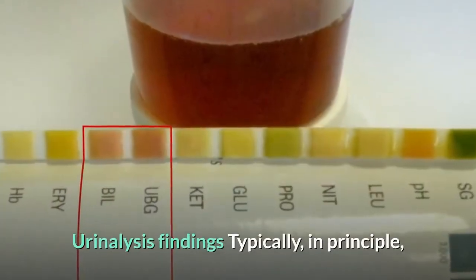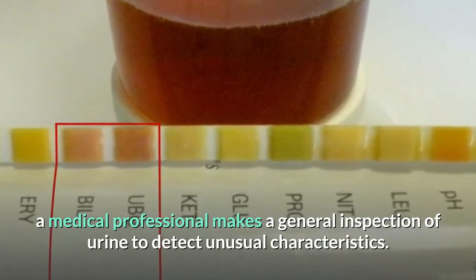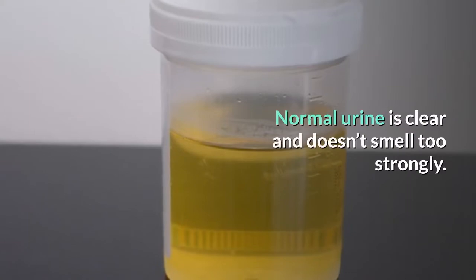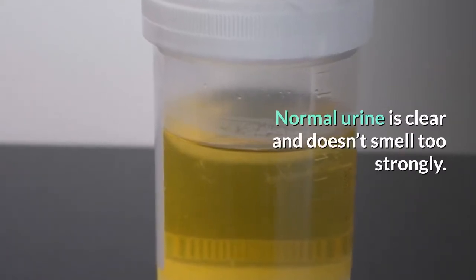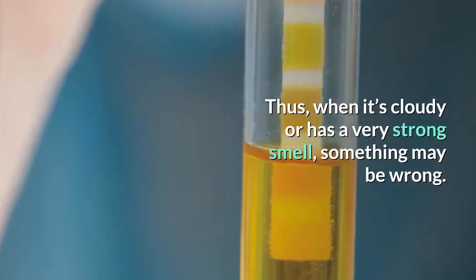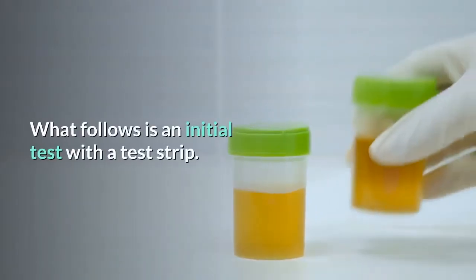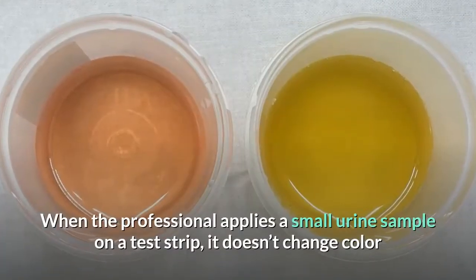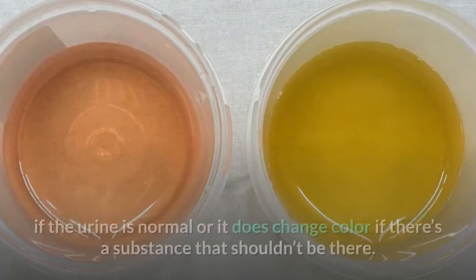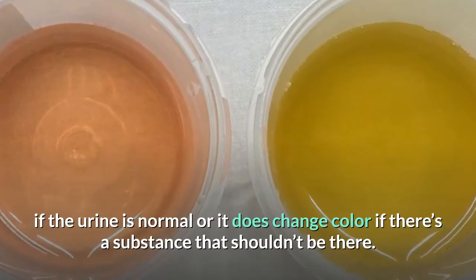Urinalysis findings. Typically, in principle, a medical professional makes a general inspection of urine to detect unusual characteristics. Normal urine is clear and doesn't smell too strongly. Thus, when it's cloudy or has a very strong smell, something may be wrong. What follows is an initial test with a test strip. When the professional applies a small urine sample on a test strip, it doesn't change color if the urine is normal, or it does change color if there's a substance that shouldn't be there.